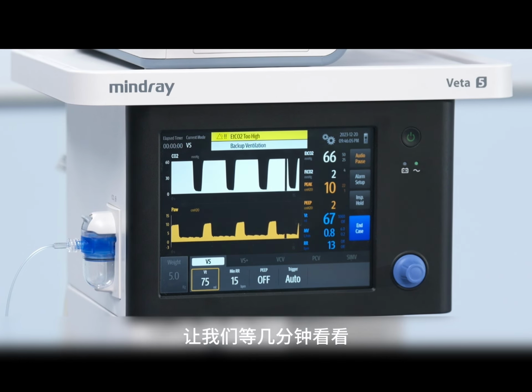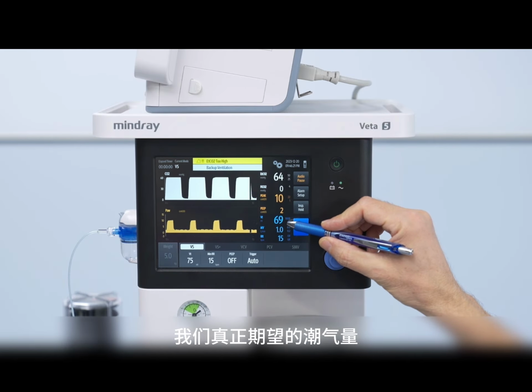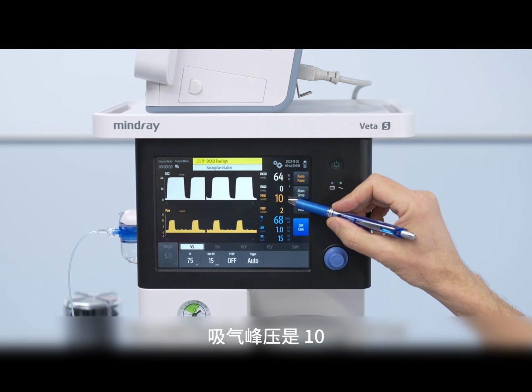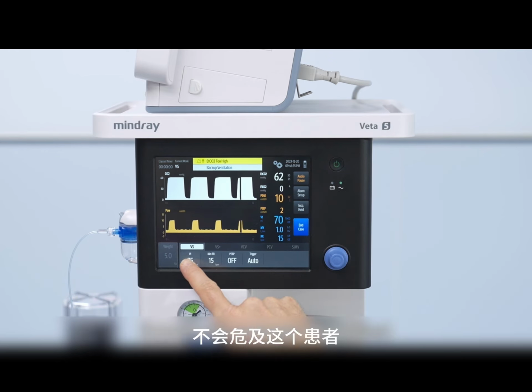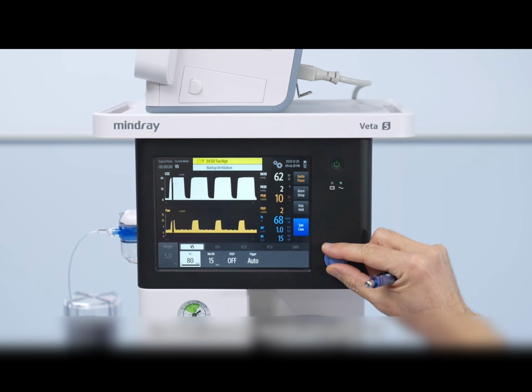Let's give it a few minutes to see if the CO2 wants to change. It's slowly decreasing, and we still don't have the tidal volume that we really desired. So I believe this could be increased a little bit more. The peak inspiratory pressure is 10, but increasing it to 11 or 12 would not make any difference. It would not endanger this patient. So I believe he needs a higher tidal volume.